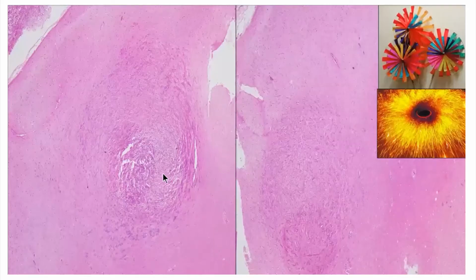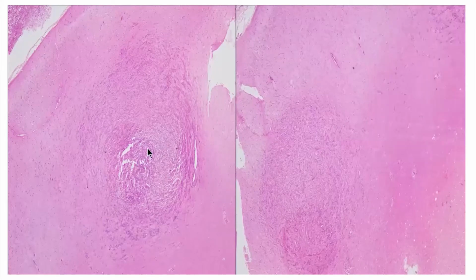So cortical based tumors are rare in ependymoma, though extraventricular ependymomas can be seen, but those supratentorial ependymomas are more common in a bit older patients, like children aged more than 10 years or in adults. But in such a young patient, it's rare to see ependymoma, and with this kind of morphology, it's not ependymoma.